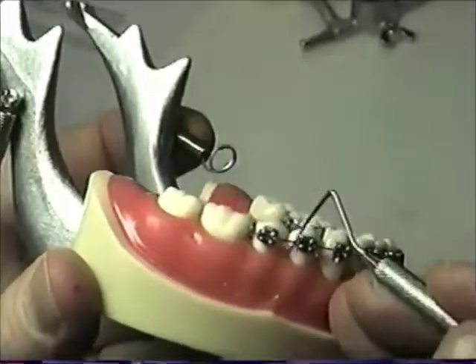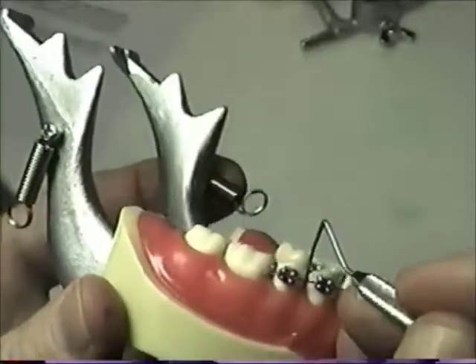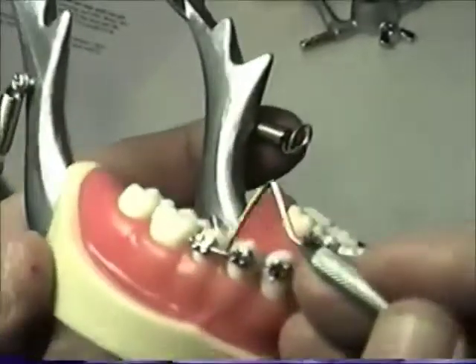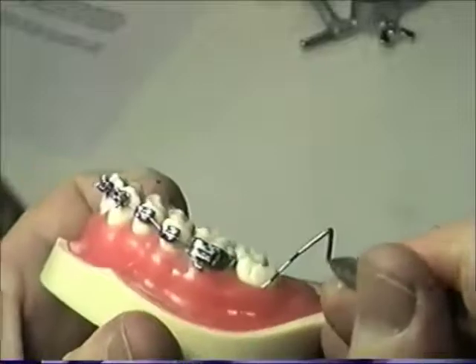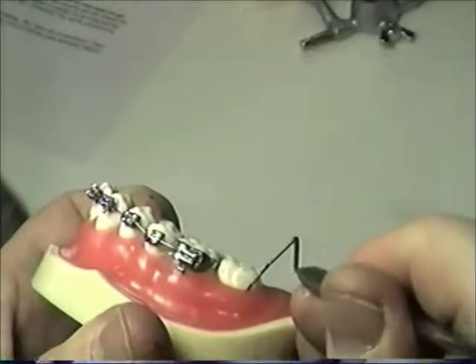And you see where I'm at now, right between here, you've got to come on this side of the wire, but down the front here, you've got to go shooting here, then you've got to run this right through here, and then follow this probe. Notice this probe is sinking up under the gums. Same thing, let's do this side here. Again, you can see the markings. There's 3 millimeters, and it sinks in. See where it sunk? It disappeared, and right there is fine.